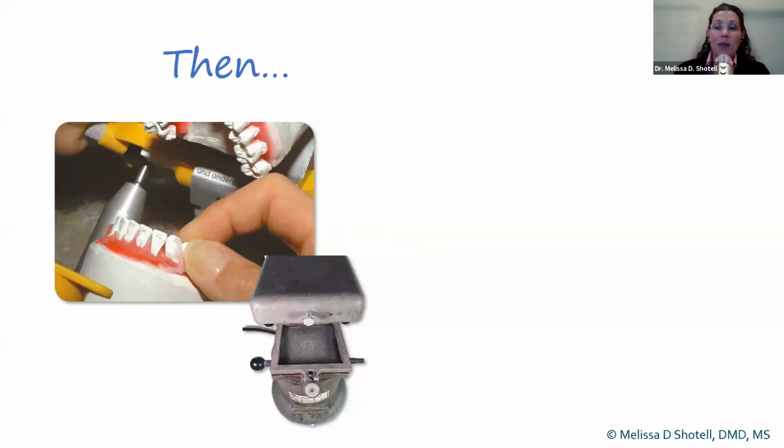So he would take a plaster cast, he would section the teeth and reset them in wax. He would take a pickup impression if needed, and then he had fabricated his own vacuum forming apparatus utilizing a steel drum, a vacuum cleaner, and an iron to heat the plastic material that he had acquired from a dry cleaner. So really a very involved process that developed in the 60s. And it continued this way for many years, even after the implementation of vacuum formers.